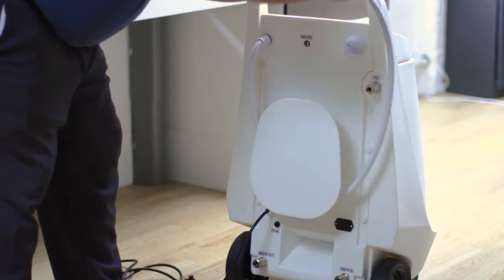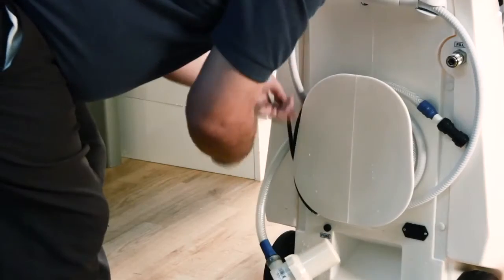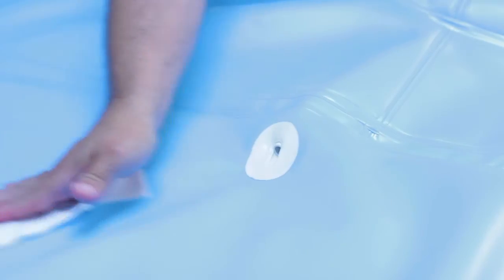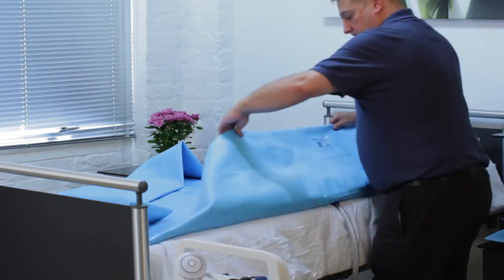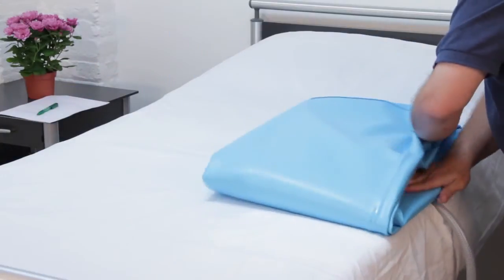Wrap the shower head around the cable tidy and the power cable for easy use next time. Dry the shower tray then clean with clinically approved wipes. Refold the bath and store the folded bath and hoses.